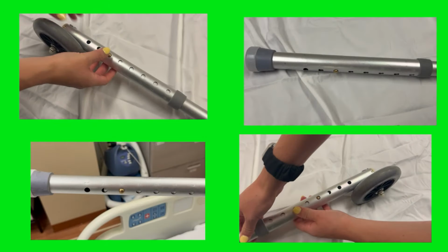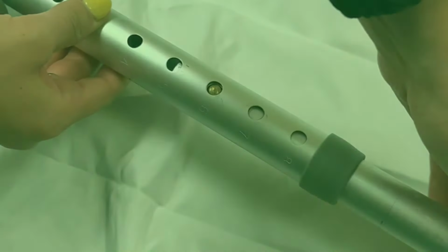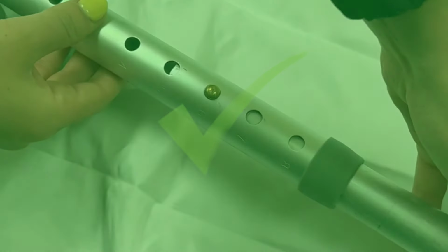Make sure that all four legs have the button protruding from the same hole, so if you adjust the back right leg to have the button on the third hole from the bottom, the other three legs must have the button at the same hole. Always ensure the button is not only visible in that hole, but that it is sticking out. Otherwise, the walker may collapse when weight is applied to it.